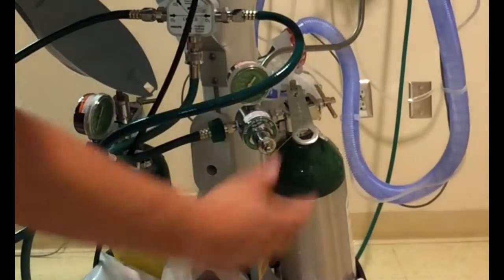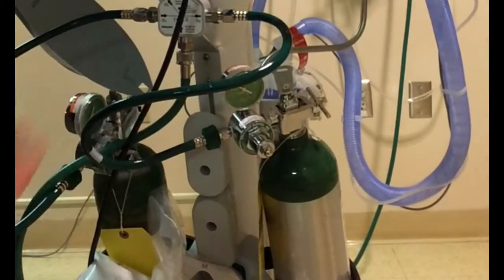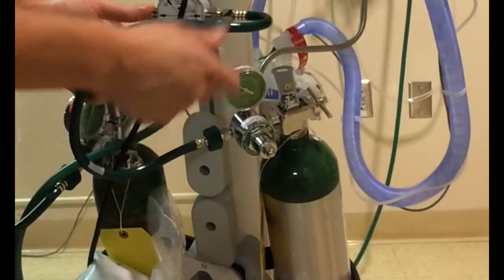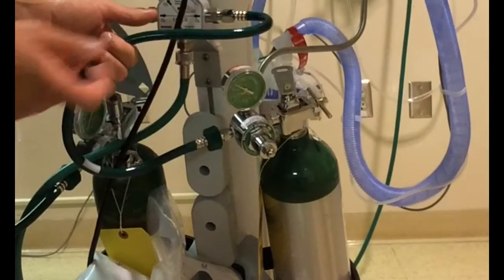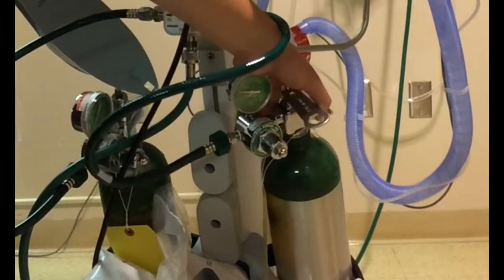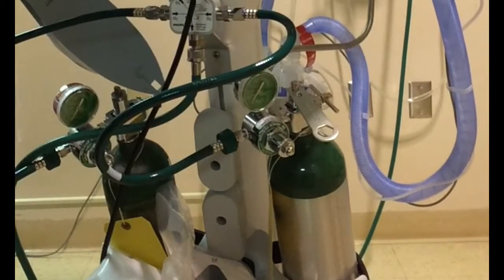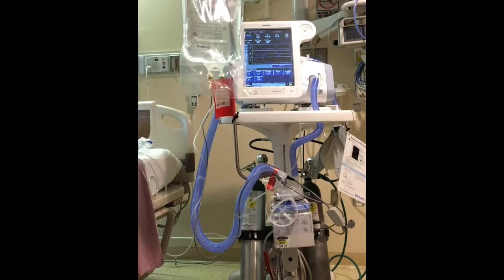All you have to do is turn one tank on at a time, and there's no regulation that you have to turn, no dials. You just turn one tank on at a time and you're ready to go. If this tank runs out, turn it off, go to your other tank, and then turn that one on. Simple as that.